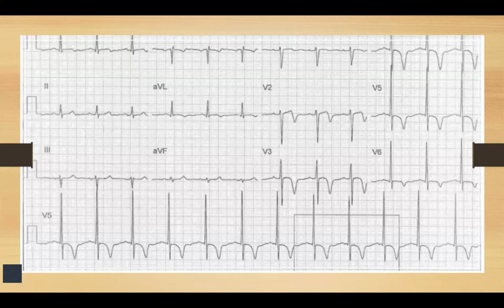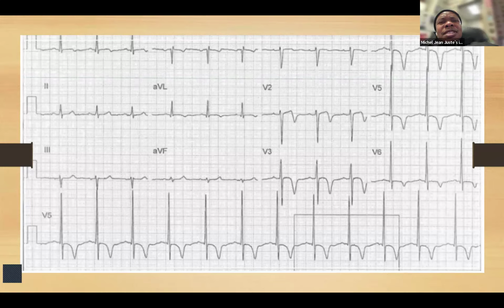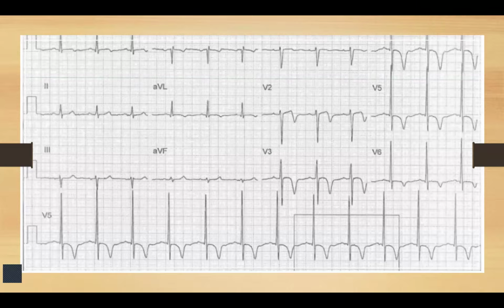And can you describe what that pattern is? I know it's the worst of the two because you have one that's almost biphasic. I think the biphasic is type A, and I think the deep inverted T's are type B. I could have it backwards. Okay.